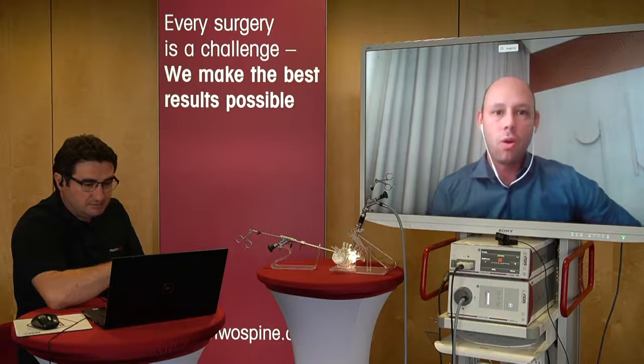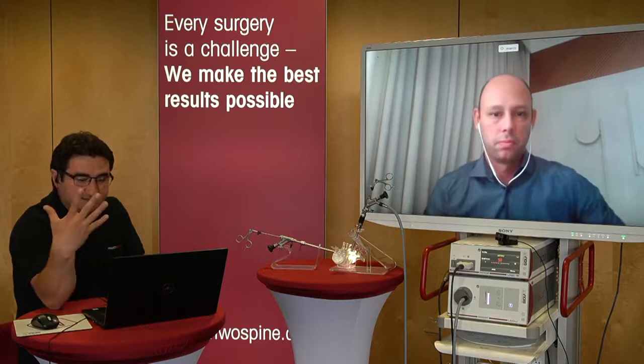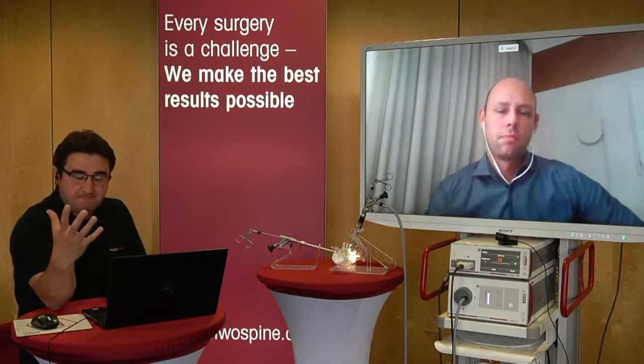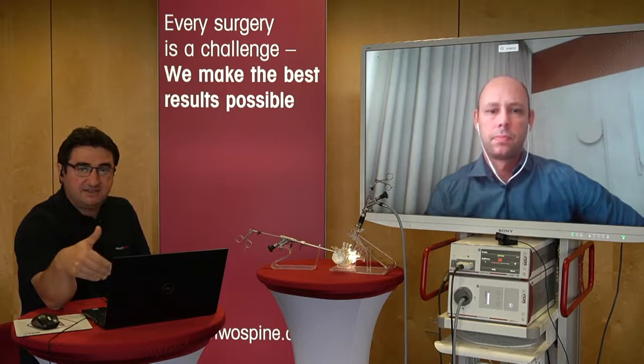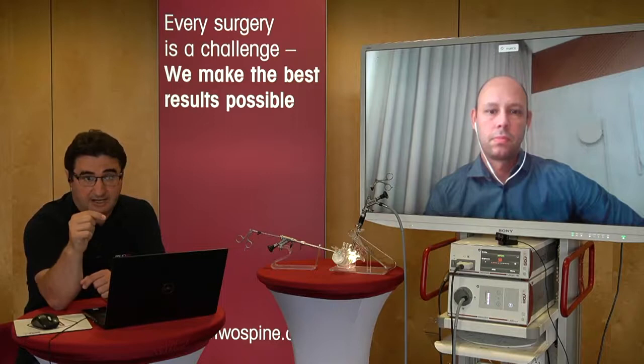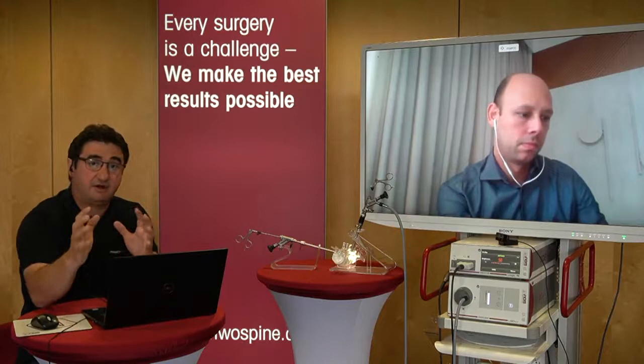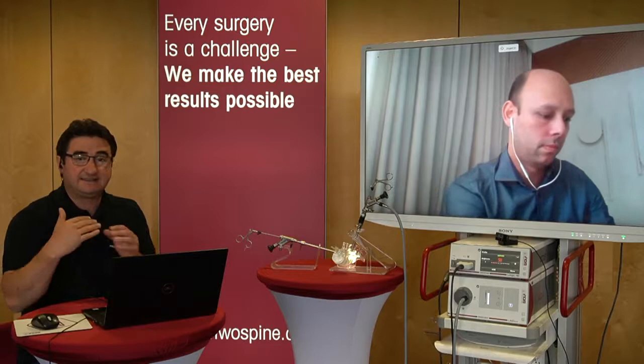You can do everything in lumbar spine surgery with the interlaminar endoscope or the transforaminal endoscope. Okay, we can answer this question maybe from my side like this. You can start with the stenosis system to do faster bone resection, posterior decompression, and then you can change to the regular system. But keep in mind, when you change the system, if you are using flow control pumps, then you have to change the tube set and the calibration of the system, because the pump system is calibrated at the beginning of the surgery according to the optic which you are working with. Don't forget to do that. Otherwise, you cannot get enough irrigation, or it will be too high or low.